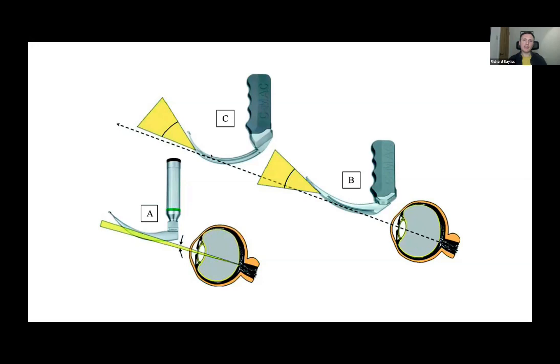If you look at C, we've got a hyperangulated type device. This is designed for a patient who's got a very anterior larynx or has some kind of anatomical abnormality that makes it very challenging for us to intubate them. So thinking about things like poor jaw movement, short jaws, short necks, immobile necks, people who've had their spine immobilized or who've got really prominent teeth.